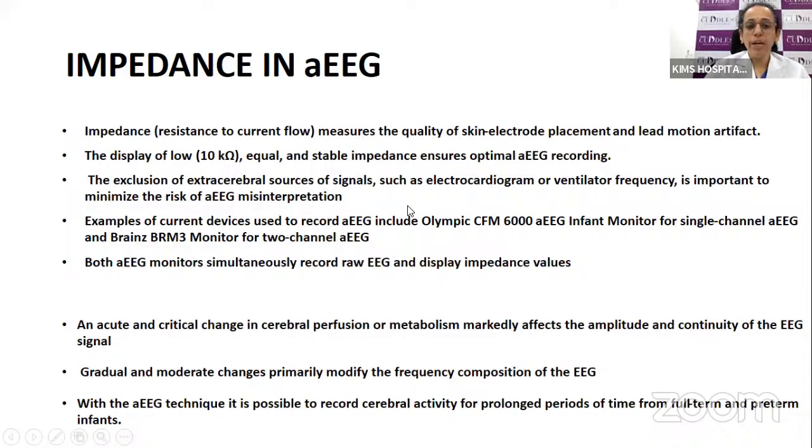There are other needle electrodes also, which are placed in the subdermal position and may be invasive, but to avoid that we are using hydrogel-based electrodes. Then we should avoid other sources of disturbance that may lead to the appearance of artifacts, such as adjusting the ventilator frequency and too many interruptions at the time of recording the EEG, like doing suction and nebulization. If any caregiving activity has been done, it is better to record that in the notes so that we can differentiate those artifacts from the original seizures.